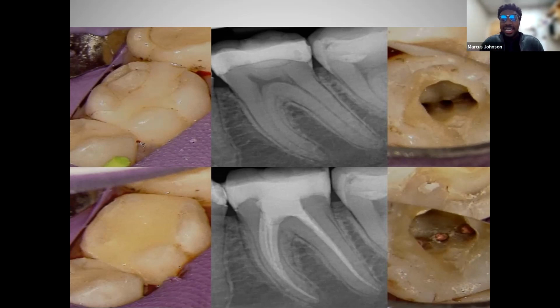And so he is one of the pioneers, if we were to maybe give this a term of restorative endodontics or dentin-directed sort of access designs. John Cotomy, Marguerite, a lot of names that when you speak, they're going to resonate within our community. And so I said, you know what? Let me start having these conversations with general dentists or those who refer to me and see how they feel about me restoring the case, especially since I'm already under isolation and I can really see what's going on with the microscope. As you can see, there was a middle mesial. There was three canals in the mesial root.